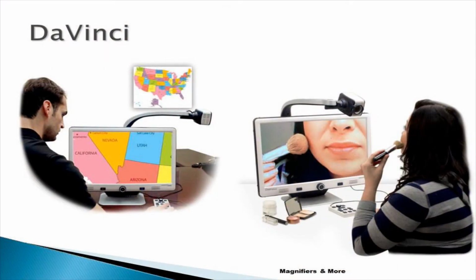The other thing that Da Vinci does is it also has a camera that we can look at distance with. So if you're in a classroom situation or at home and you want to spy on the neighbors or you want to look at TV, you can move the camera and zoom in and out, and it'll be on your screen. And then the camera can also be turned to face towards you, and it's what we call self-viewing. So if you want to put on makeup or shave, or comb your hair, or put in earrings, it gives you that self-image. And sometimes it's scary, so I will warn you. But that's the Da Vinci, and again, Da Vinci is out in the hallway there if anybody wants to see it.